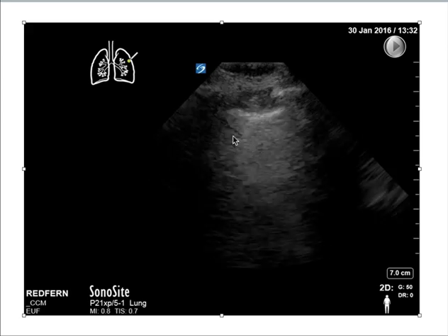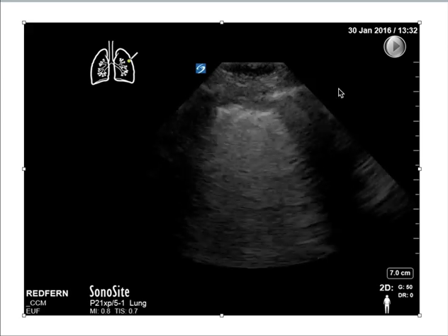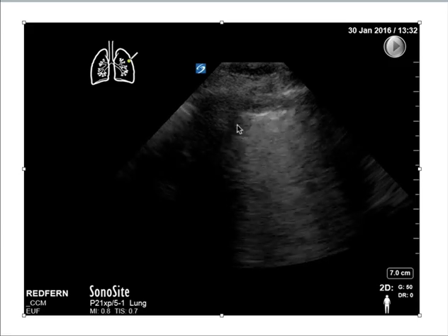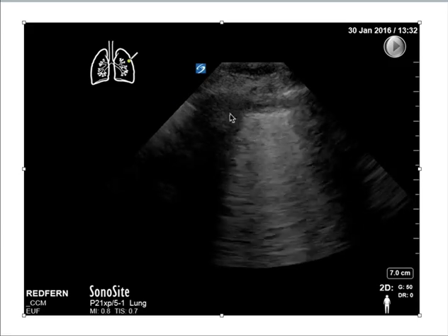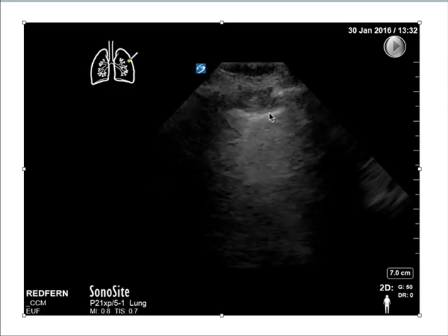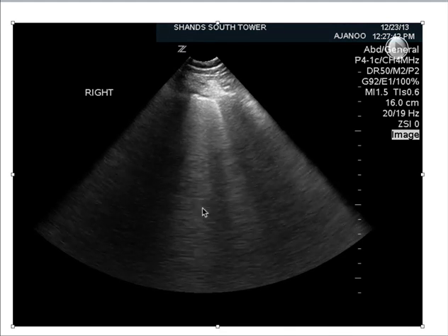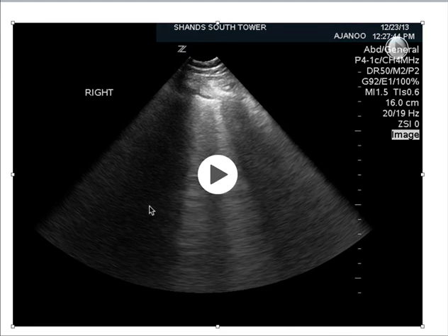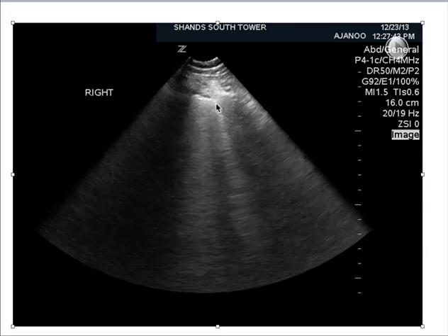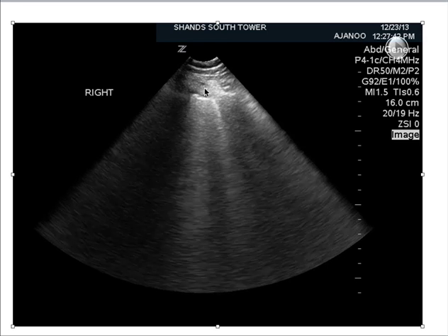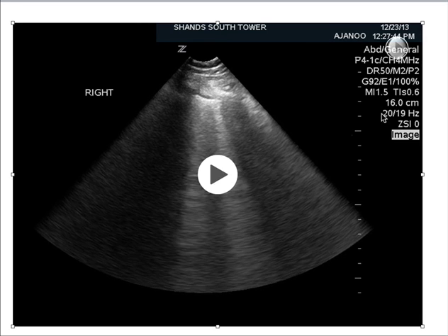Here's a patient that's zoomed in a little bit. You see the rib with a rib shadow, rib with a rib shadow. You see the pleura, and you see these B lines that shoot all the way down to the bottom, and then you can definitely see some lung sliding. Here's a patient with absent lung sliding — you see two B lines, but you don't see any movement of the pleura. The depth is about 16 centimeters, so it would be more beneficial to zoom in to that area and reduce the gain to clarify that there is no lung sliding.